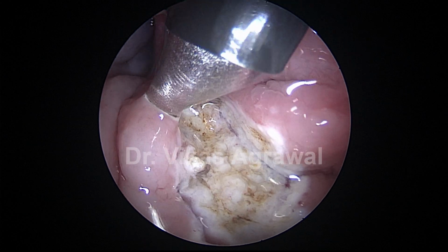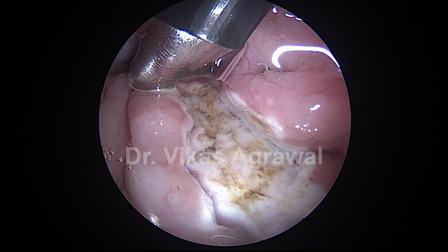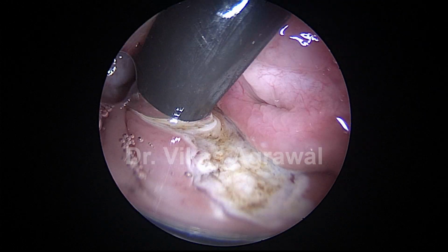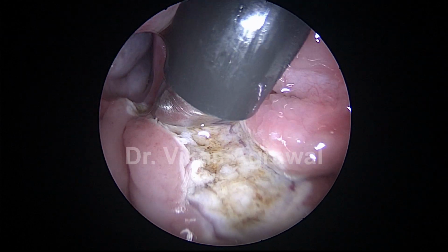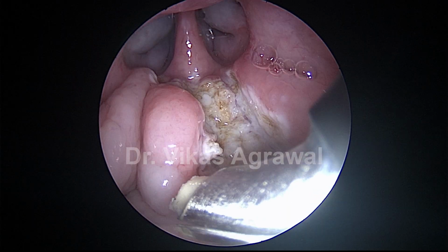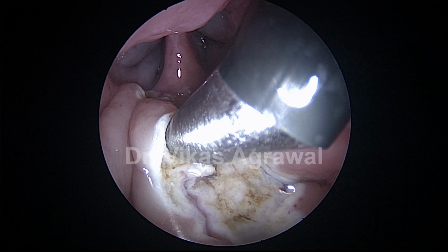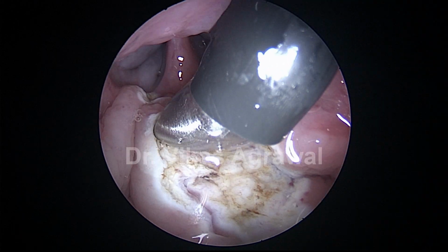Now that's the choanal adenoid on the right side. That's the torus tubarius. So on the superior part of the torus tubarius, there are some choanal adenoids which I'll remove, and I'll first remove the total bulk and then finally go for the finer work.